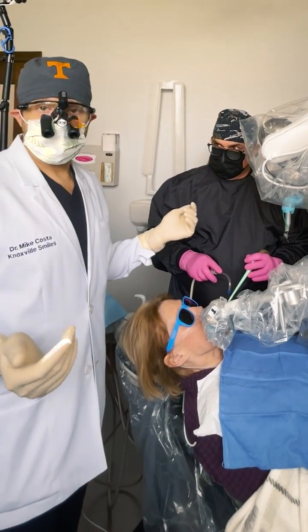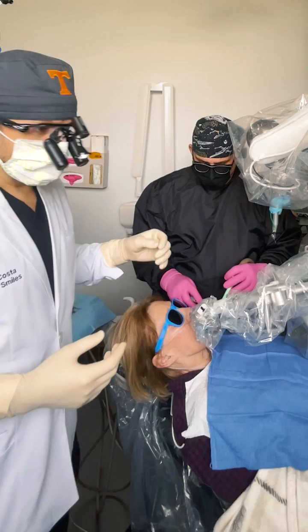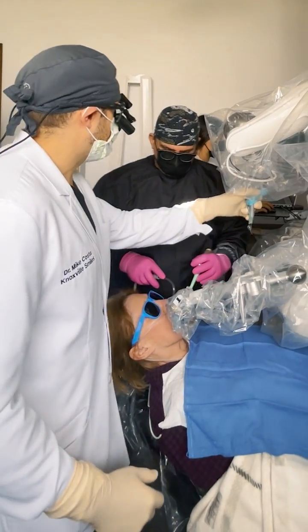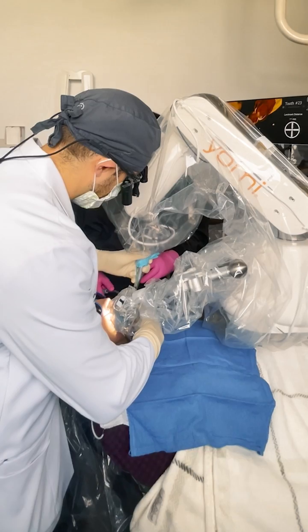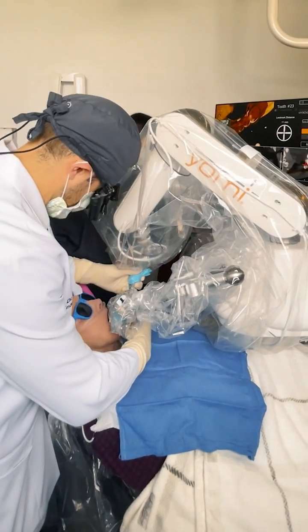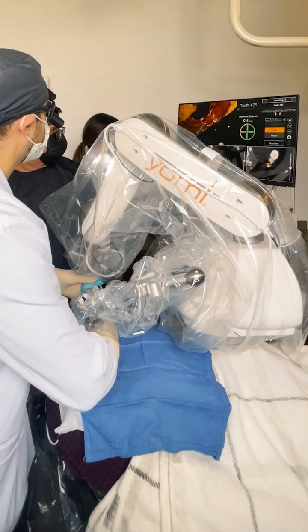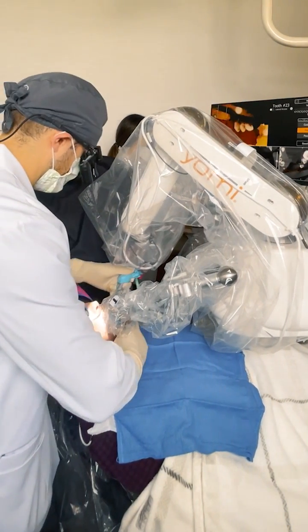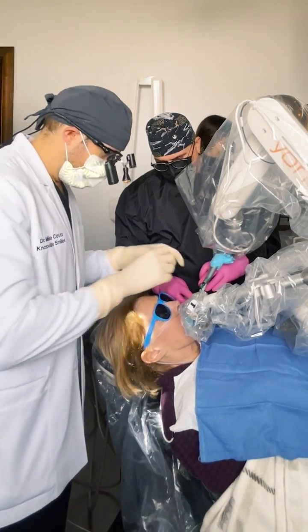All right, so we're going to go ahead and find our landmark, which is going to tell us how accurately we have merged the robot with our CBCT. Freeze. Open real big. Good. First trim on. It's beautiful. Now that we're synchronized, we can go ahead and start placing our osteotomy.